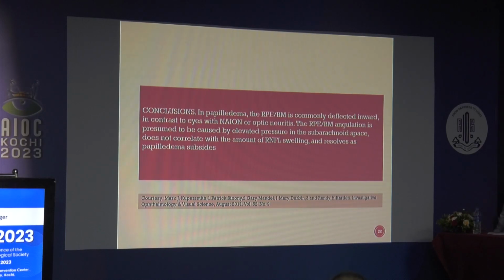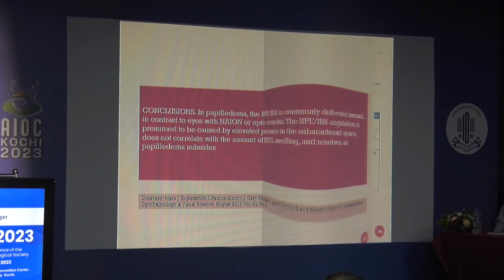So this angulation is presumed to be caused because of elevated pressure in the subarachnoid space, but it does not correlate with the amount of RNFL. This is just a finding. We cannot correlate this angulation with the RNFL thickness values.